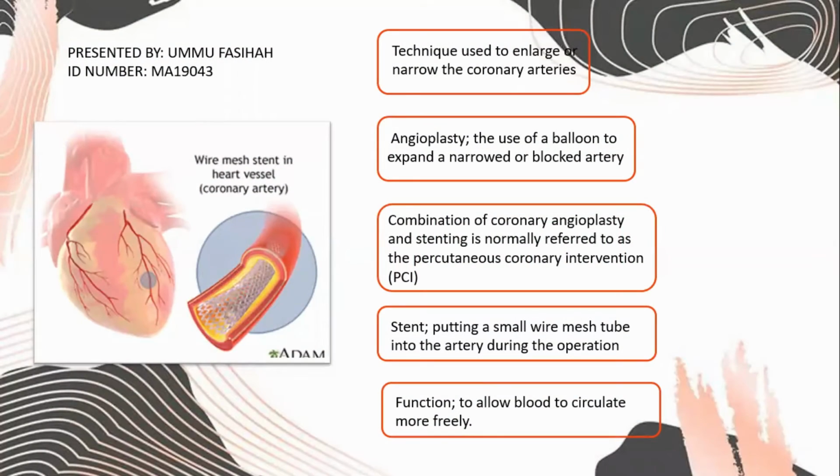Coronary angioplasty is a technique used to enlarge the narrowed coronary arteries. The word angioplasty means the use of a balloon to expand a narrow or blocked artery. The combination of coronary angioplasty and stenting is normally referred to as percutaneous coronary intervention, which is PCI.